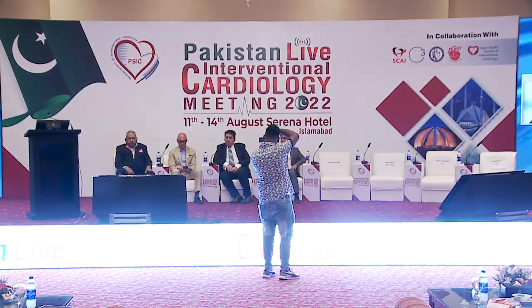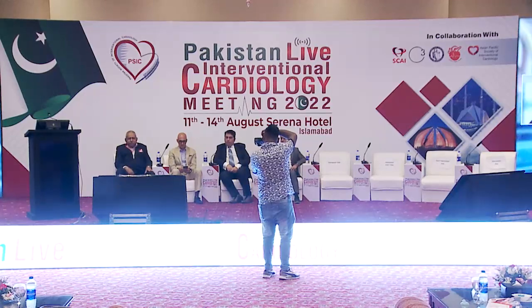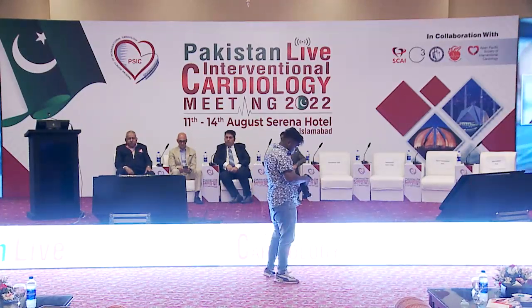So TAVR is now an established procedure that is done in, I believe, approximately 700 centers in the United States. And we went from doing 1 or 2 a week to now doing 2 or 3 a day in our cath lab. And it's really a tremendous procedure.